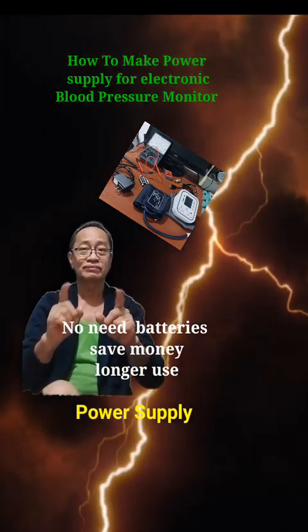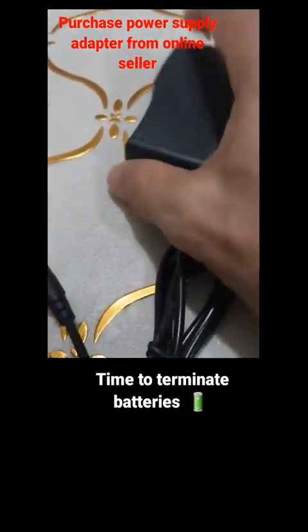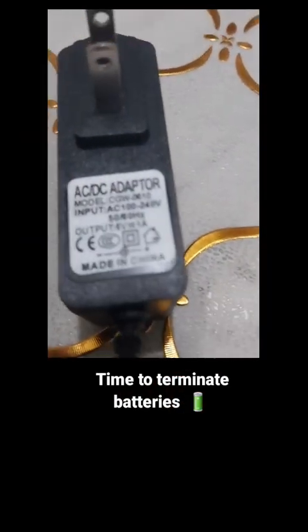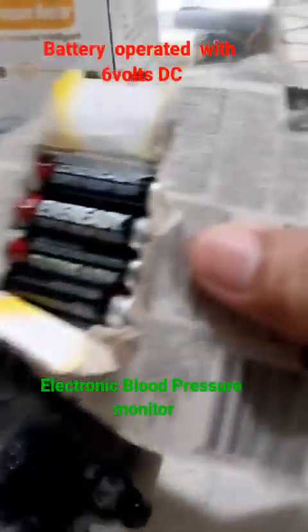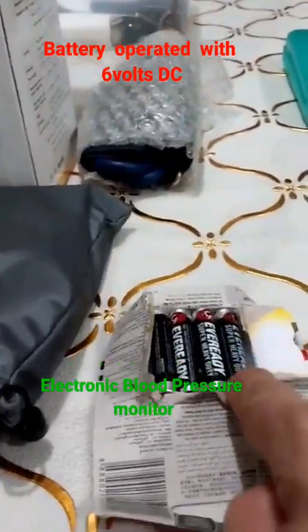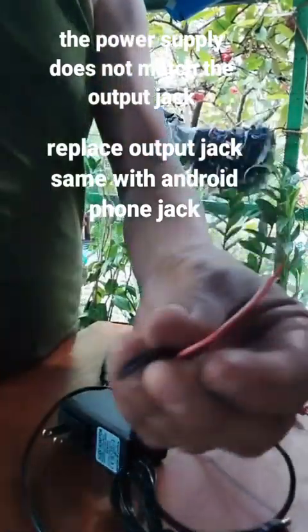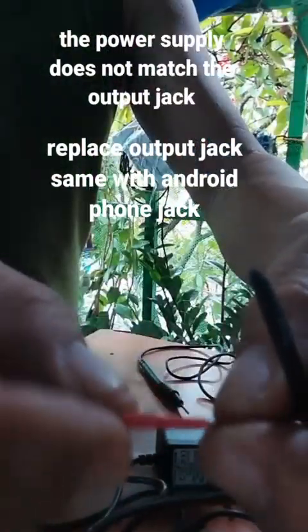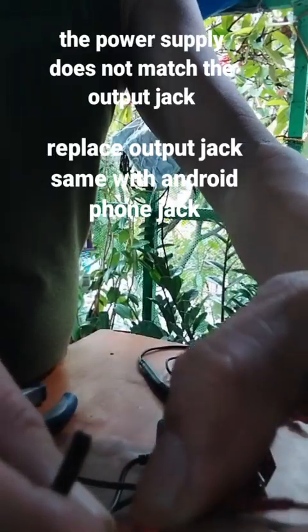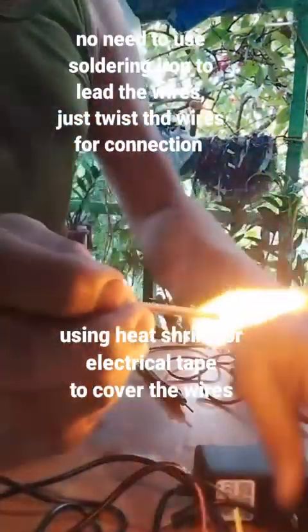Welcome to my YouTube channel. I purchased a power supply adapter from an online seller — 220 volts AC input and 6 volt DC output — for an electronic blood pressure monitor that is battery operated. We replace the battery with a power supply adapter, AC to DC, to limit the weakness of the battery.